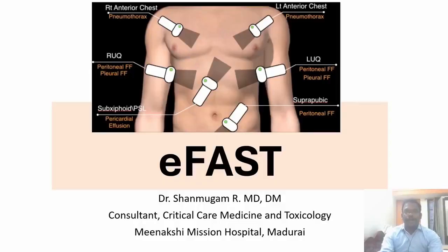Good morning to everyone. I am Dr. Shanmugam, Critical Care Medicine Consultant from Meenakshi Hospital, Madurai. Today we have an academic session on EFAST, Extended Focused Assessment with Sonography in Trauma, and I wish to keep this class as simple and practical as possible.